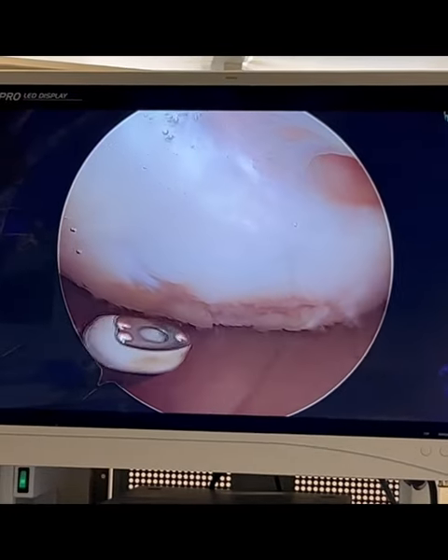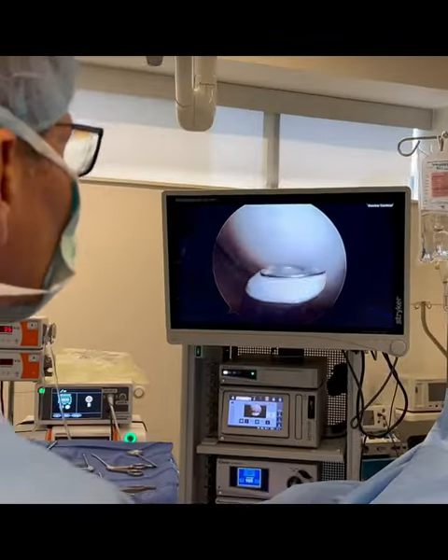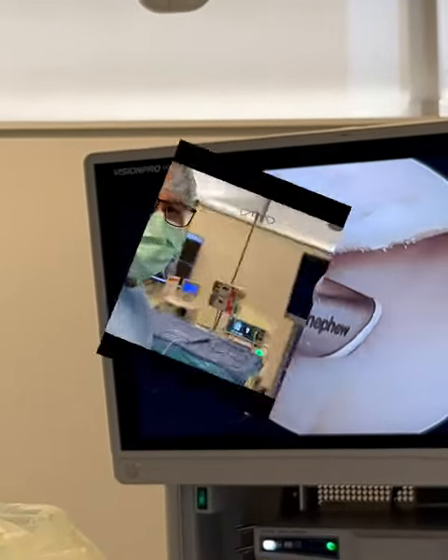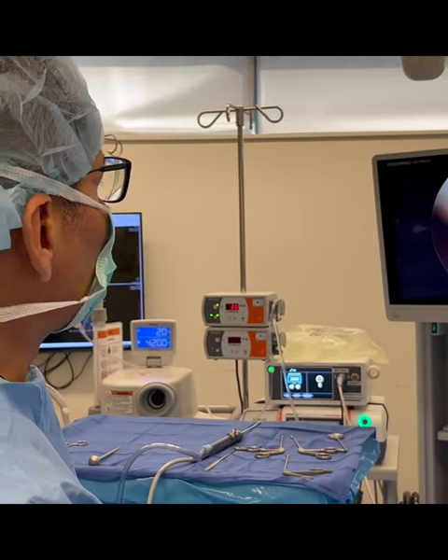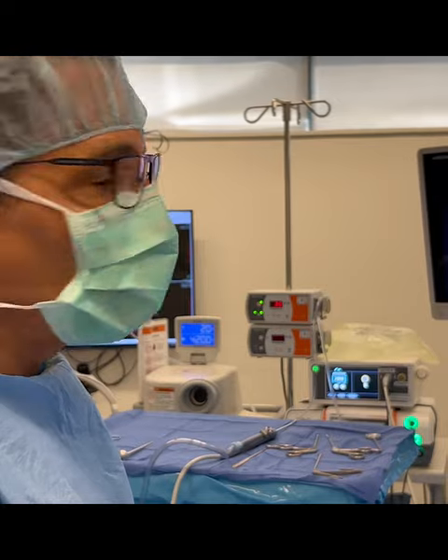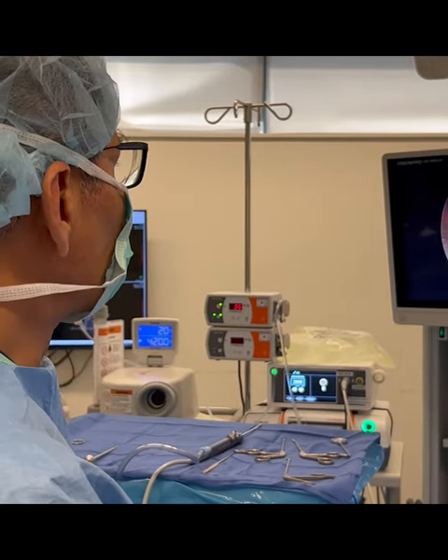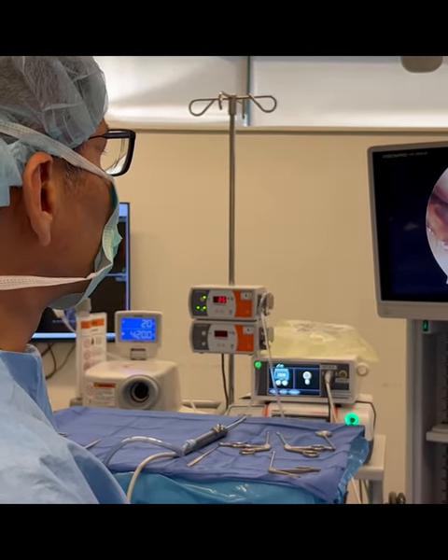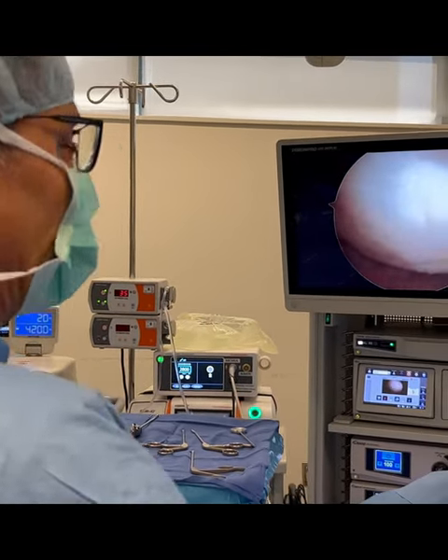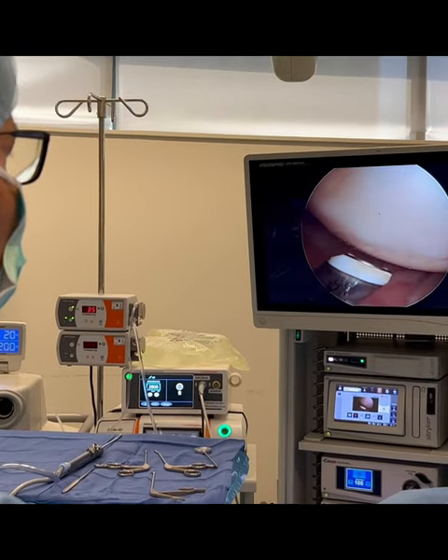I just wanted to show you what chondroplasty means and the difference between articular cartilage and meniscus cartilage. Ladies and gentlemen, I wanted to show you what this lesion looks like after the chondroplasty. Chondroplasty is the word of the day. I wanted to once again show you this lesion — this chondral defect, also known as an articular cartilage defect — that I just showed you a moment ago.